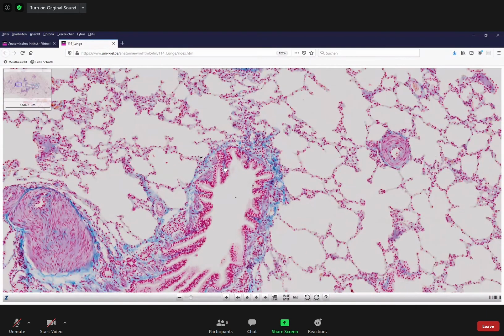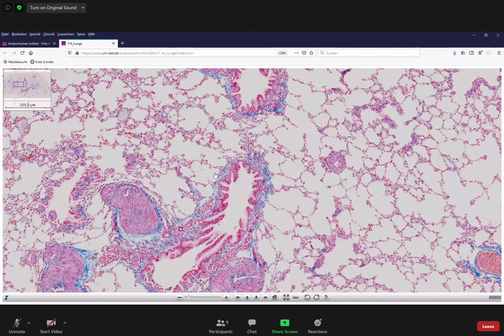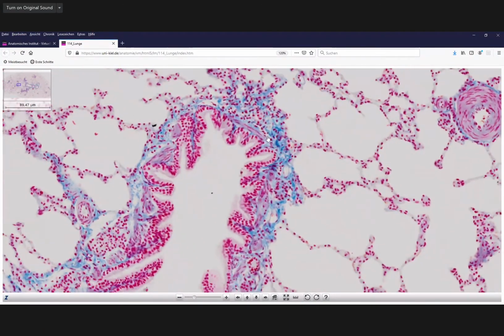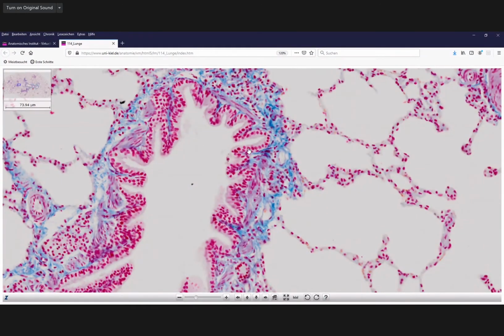So when we repeat this, a typical bronchiole has a cuboidal simple epithelium, less and less ciliated cells and goblet cells, but instead club cells appear. And then there is smooth muscle tissue also, and it's like the one in the bronchi.